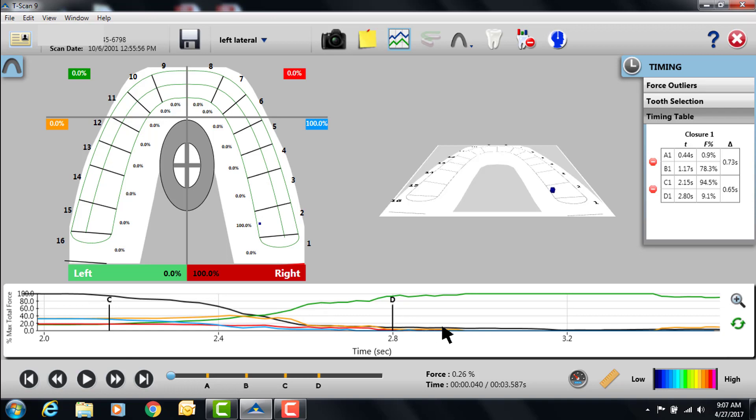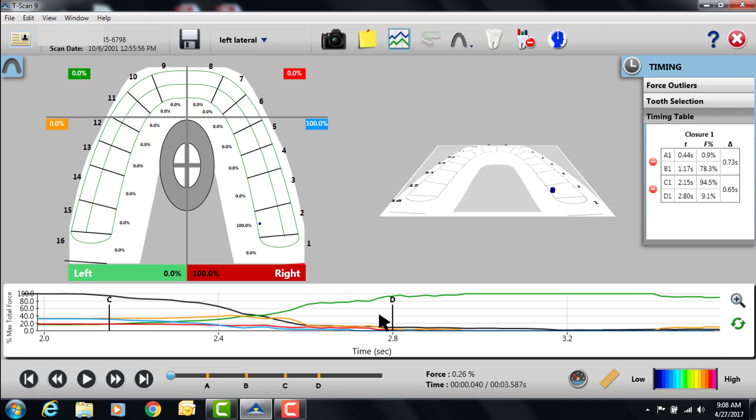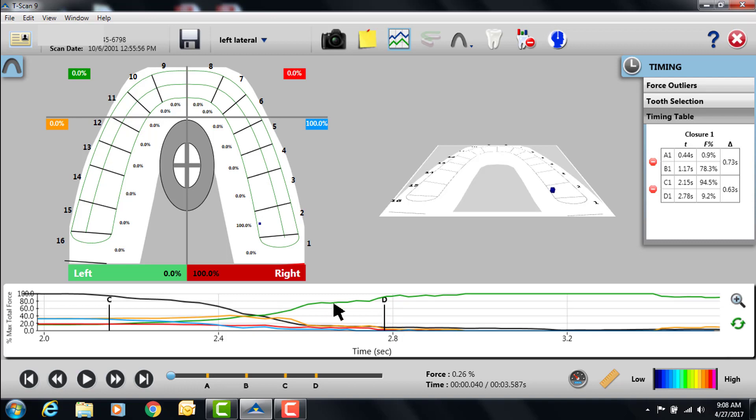Same thing with the D line, but it's a little bit different in regards to, we're looking for the D line to be placed where the yellow and blue lines hit zero. And the idea behind this is we look for immediate posterior disclusion, and so you're not discluded until the posterior teeth are completely at zero. And so you can see here, if you look closely, and you can probably zoom in more to get more clarity, the yellow line kind of hovers and it hits zero right about here. So we can actually take the D line and move it about a half an inch. Alright, and there you go.